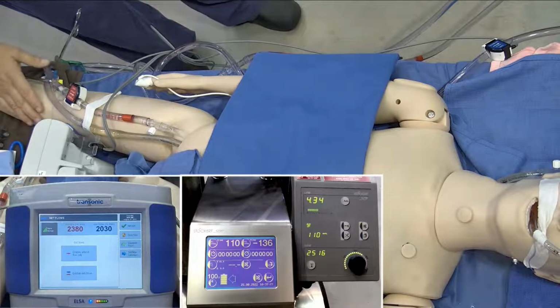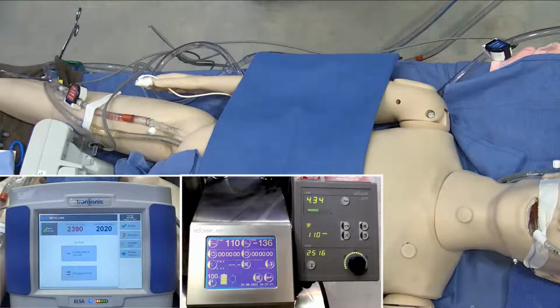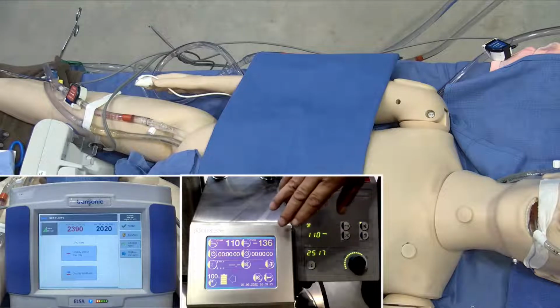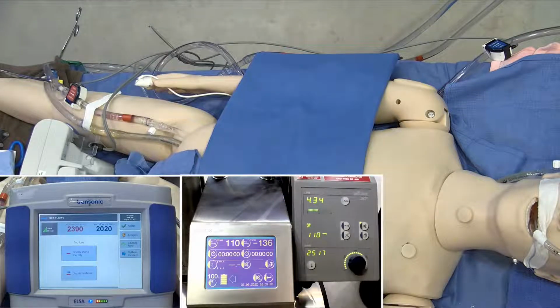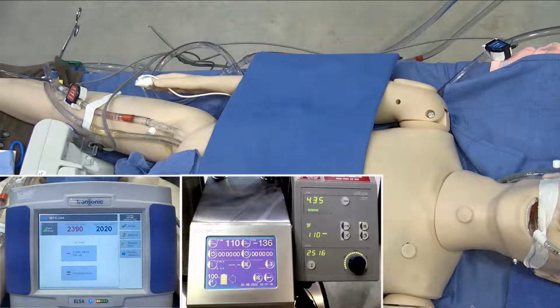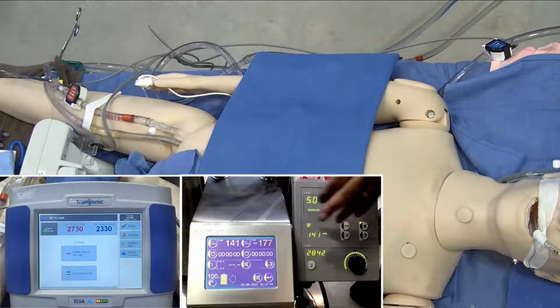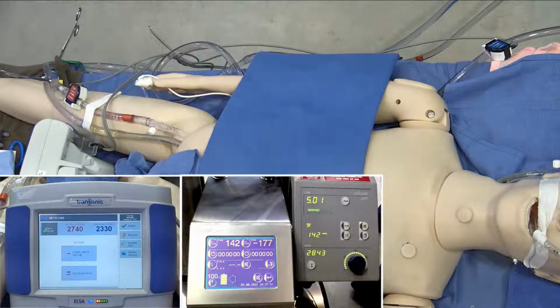Now, the trade-off is, if we go over here and look, we can see that our access pressure is already 136 negative. So how much more flow can I really get? Because the patient was getting 4.5 systemically. But I think we're going to go ahead and turn it up and see if we can at least generate a higher level of flow. And now we're at 5 liters with 2,800 RPM, and our access pressure is 177.